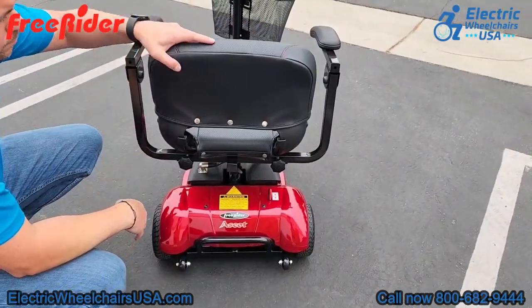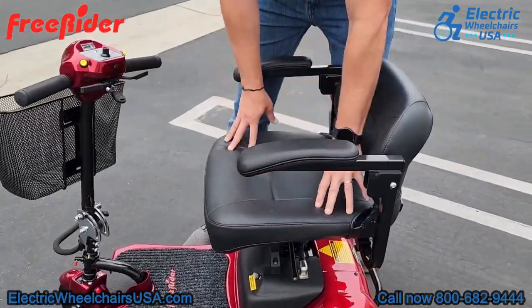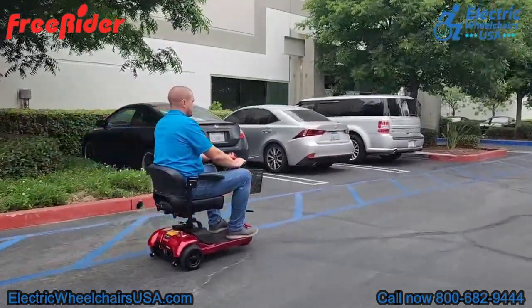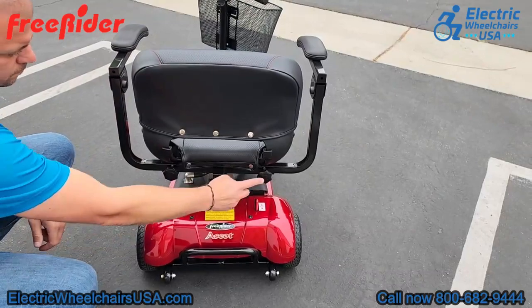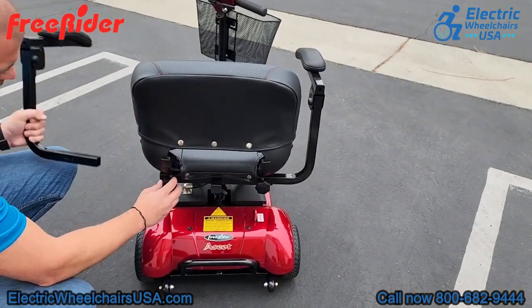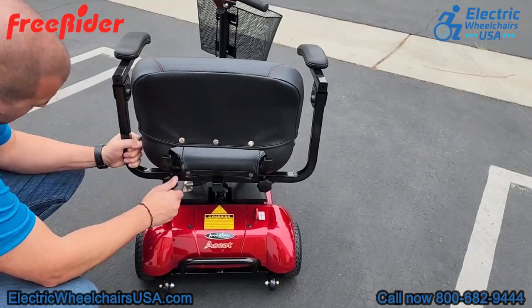One thing that's really nice about the Ascot 3 is that it has a super comfortable stadium-style seat that has a lot of padding and a long battery range of up to 15 miles on a single charge. Right below the back of the seat there are two knobs that you can adjust — this will adjust the width of the armrests, or you can even remove the armrests if you wanted to.